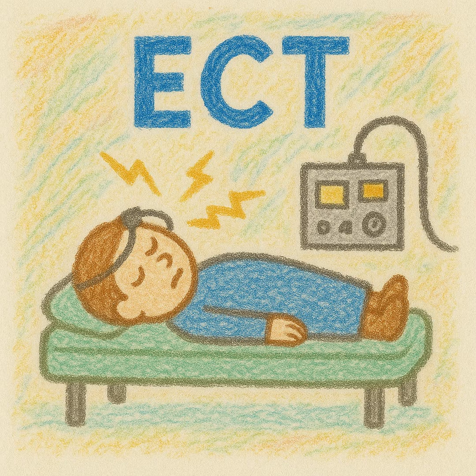The cuff technique can also be helpful because every once in a while you'll have someone that is not fully anesthetized. So they could be paralyzed but not fully anesthetized. And so you could ask them, hey, Bob, can you wiggle your right toes? And if they're still awake and able to wiggle their toes, then they're not deep enough in anesthesia. And it's pretty scary to be paralyzed and not unconscious. So it can be helpful with that.